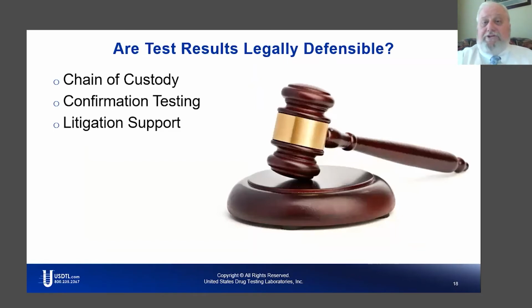So talking about litigation support, do these results hold up in court? So far, so good. We've been challenged on numerous occasions. It comes down to this type of testing being abstinence monitoring. There are so many variables that we cannot backtrack and determine time, dosage, and frequency.